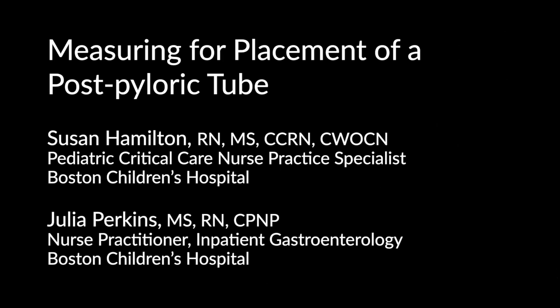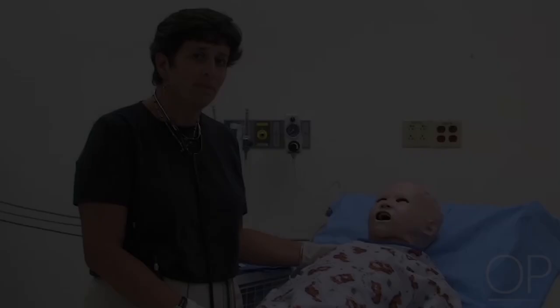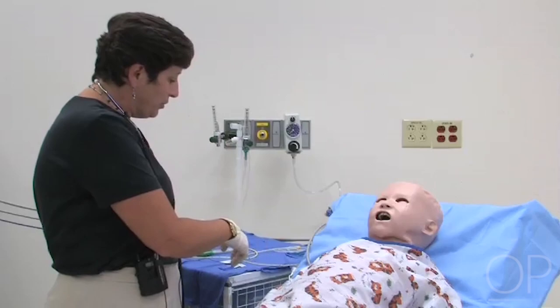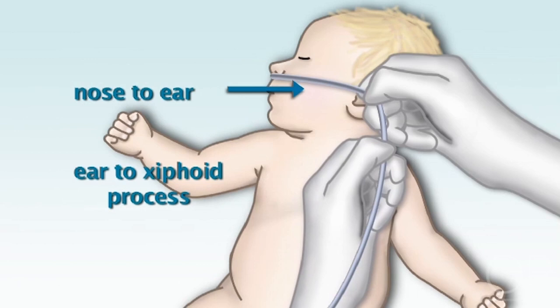Measuring for Placement of a Post-Pyloric Tube by Susan Hamilton and Julia Perkins. The first thing we want to do in order to place a tube is to make the measurements. I'm going to use the styleted feeding tube. If I was only going to the stomach, I would start with my measurement of nose to ear and ear to xiphoid, and that measurement would be for stomach placement.